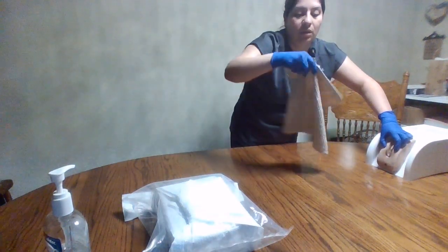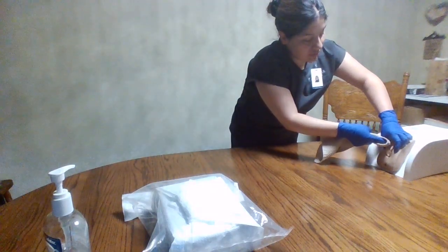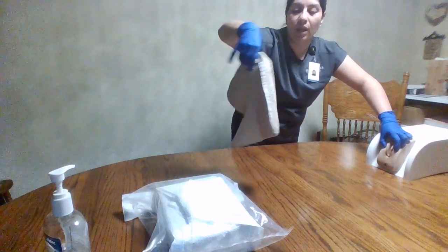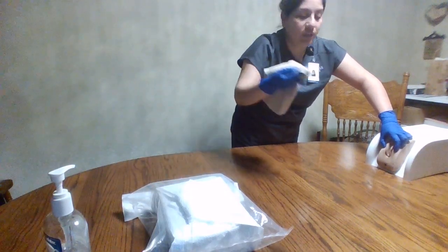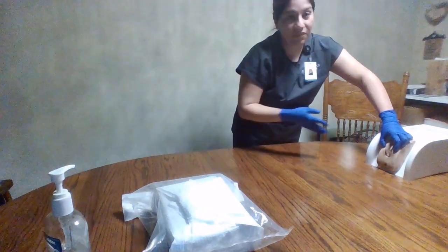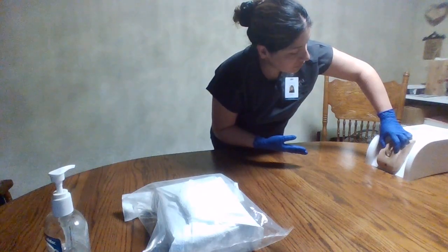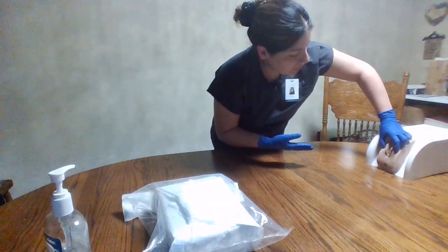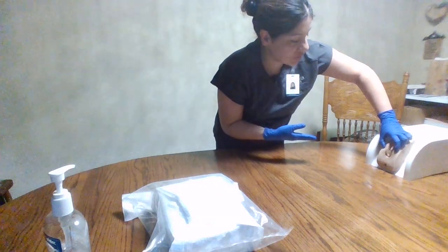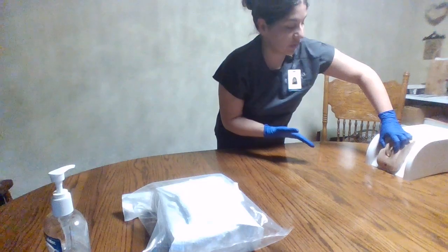And I will switch corners with the labia that is closest from top to bottom. And then switching corners from top to bottom down the middle, and I will dispose of that towel as well. I will inspect and visualize for the urinary meatus at this time. I will also inspect for any redness, swelling, irritation, or foul odor.